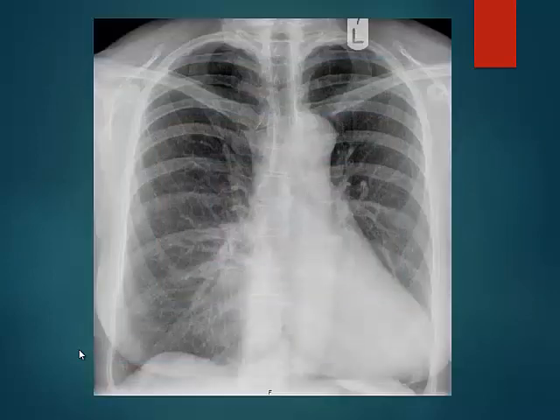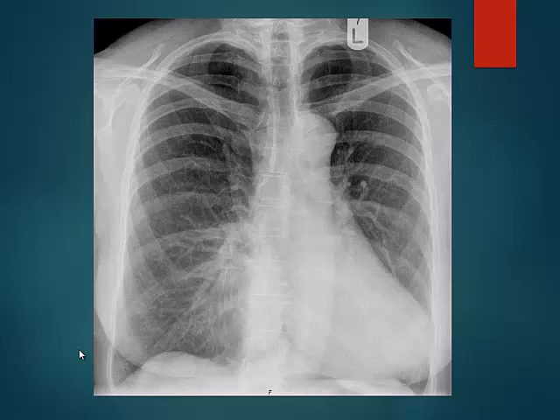Okay, so last X-ray. What about this? What are the findings here? Some cardiomegaly, okay. Okay, define the features first and then come to diagnosis. So right heart border is, can you see it? Can you see the right heart border? No, it's displaced to the left, isn't it? So it's behind the sternum. And there is some haziness here in the right paracardiac region. What else?